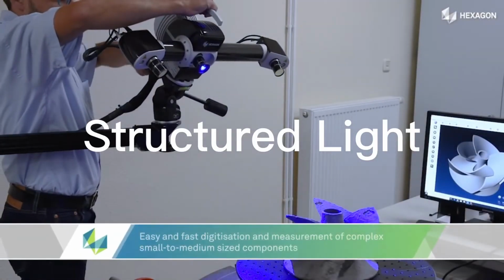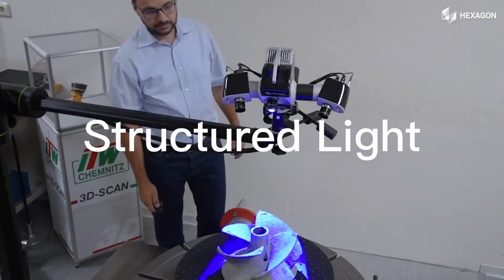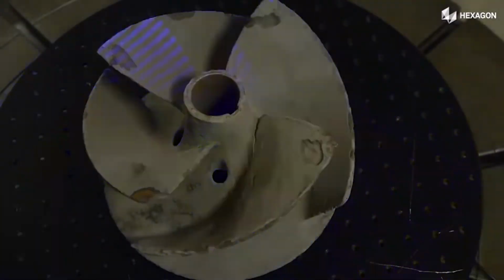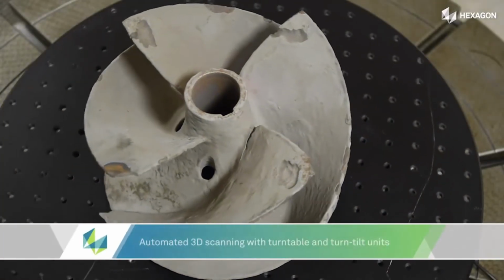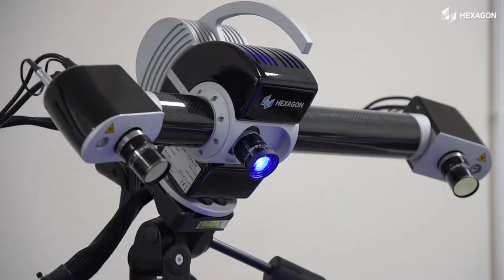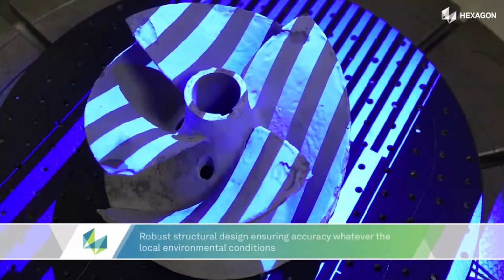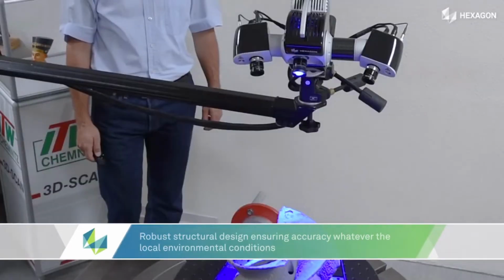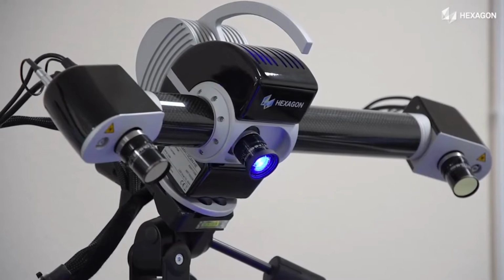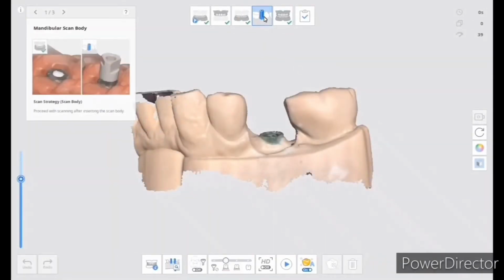Next, let's look at structured light triangulation. Structured light triangulation imaging is a system structure composed of a projector and a camera. After the projector is used to project specific light information to the object surface and background, the camera collects the image. According to the change of optical signal caused by the object, the position and depth of the object are calculated, and then the whole three-dimensional space is restored.